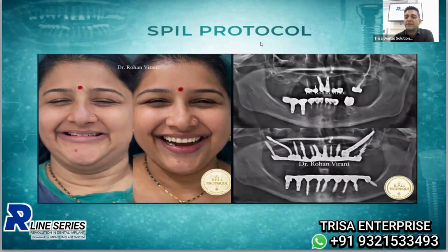In the lower jaw, we place the BCS in the anterior mandible in extraction sockets, and posteriorly, I do a nerve bypass, which means you are seeing the first of its kind crazy case: conventional implant on the left side, basal zygomatic implant on the other side, conventional zygomatic implant on the other side, BCS implants in the anterior maxilla connected to her earlier existing integrated conventional implants, and in the mandible the conventional integrated implants connected to the BCS implants, all keeping the ego aside, using simple, simplistic drilling protocols to give her a happy smile.